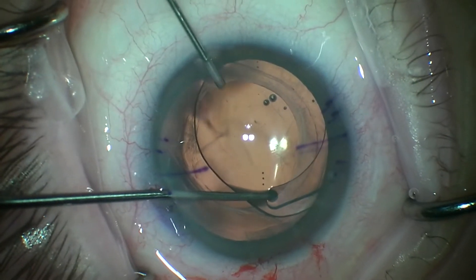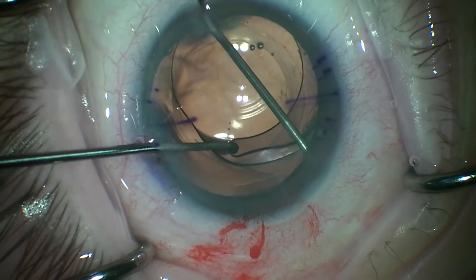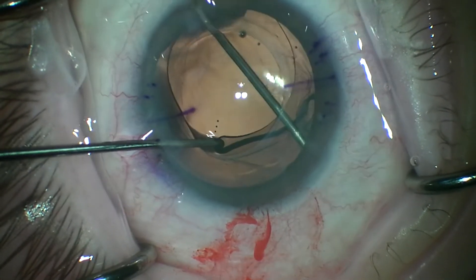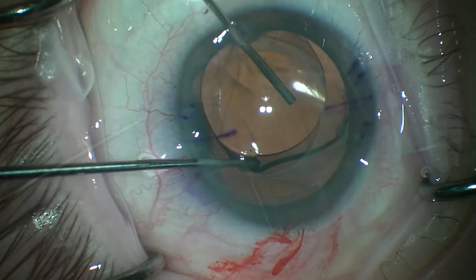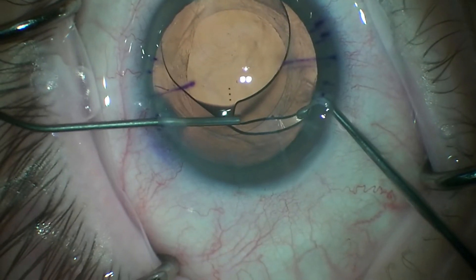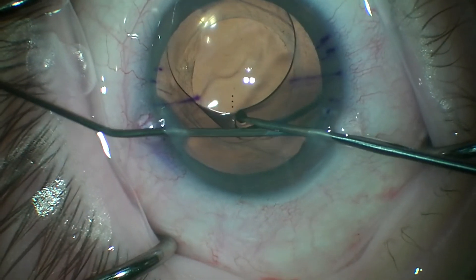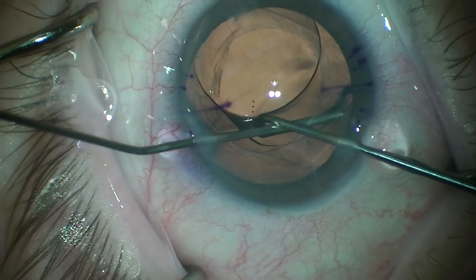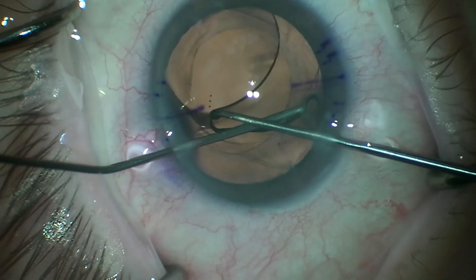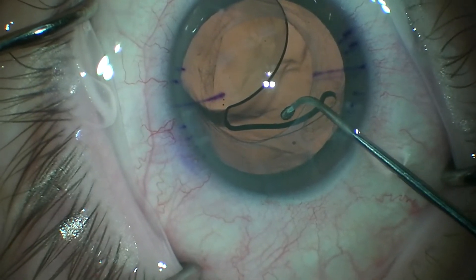We are aware that there's vitreous behind us, so we gave a little bit more viscoelastic. It's the haptic at the bottom of the screen that's really problematic. Alcon single-piece acrylic lenses have a terminal bulb on the end that tends to get fibrosed, and Alcon acrylic in general is much more reactive to the capsule — you get more fibrosis, capsular scarring, and sometimes even phimosis if your capsulorhexis is too small. It is much more challenging to exchange an Alcon single-piece that has been in a while than a Johnson & Johnson or Bausch & Lomb lens, but we finally got that haptic freed up.